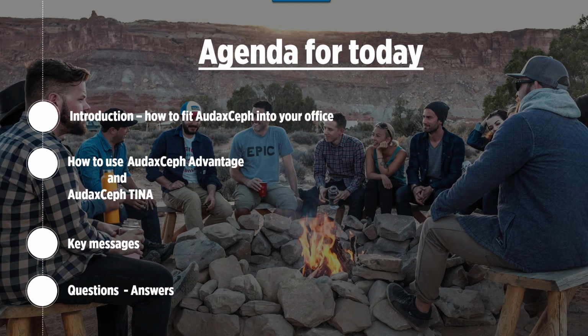Finally, before Q&A, we'll talk about things which are important for your practice and which software in your practice must have. We are aware that all of you have specific requests, specific questions which may not be covered during the presentation. Again, I encourage you to ask us through the chat pane or later send us an email.